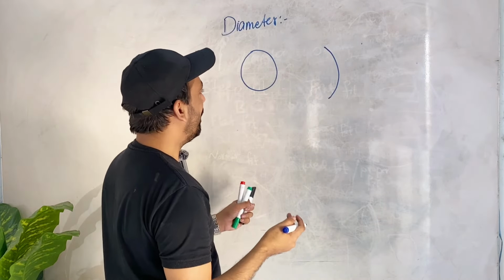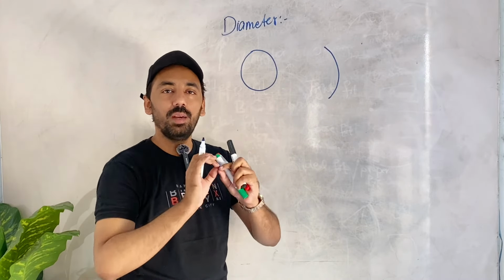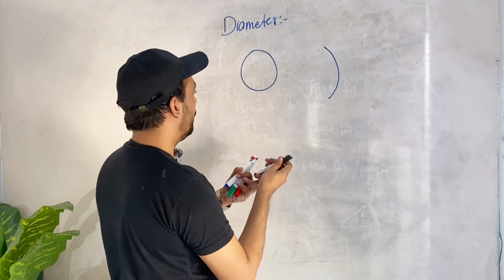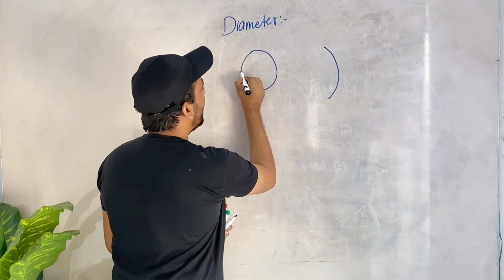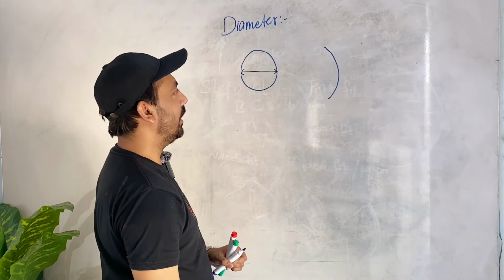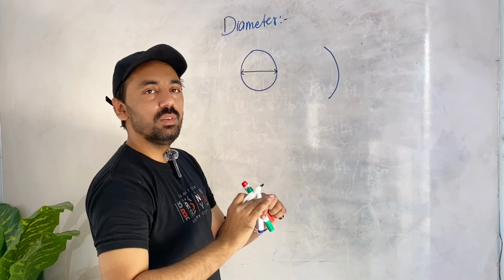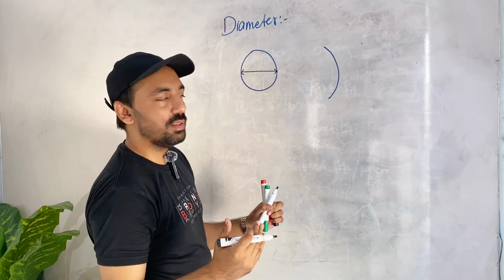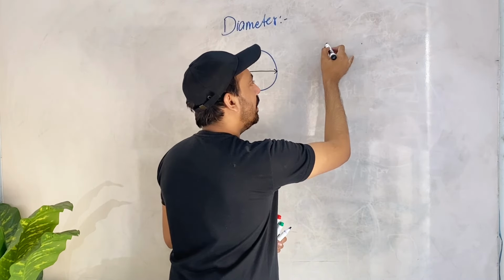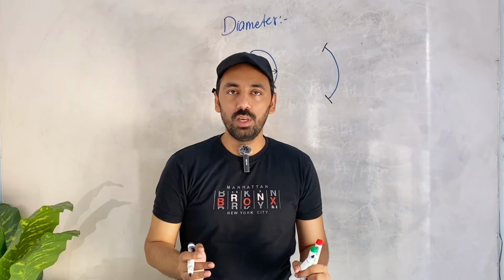So we will discuss the diameter. I tell you the definition of the diameter. The diameter is actually the widest part of the contact lens, the widest width of the contact lens. So that is called the diameter. This line is actually representing the diameter of the contact lens, the widest line of the contact lens, right? So in this contact lens, from the lateral view, the distance between this point and this point is called the widest part. This is called the diameter of the contact lens, right?